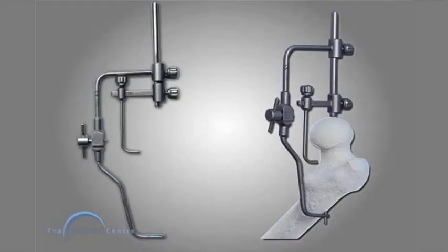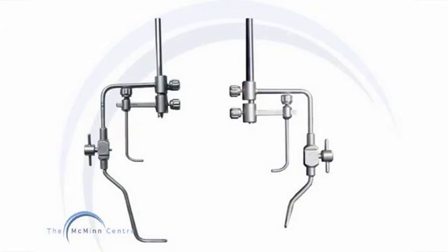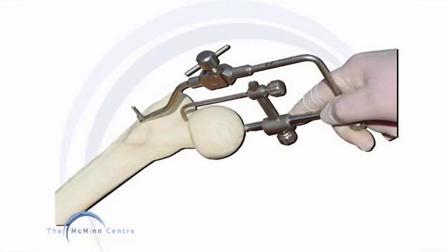This is the old femoral alignment jig, which was in use through the conventional approach. The long arm of the jig had to reach the outer surface of the upper femur. In order to reach that point, a larger incision is needed. Modifications in the femoral alignment jig allow the new jig to be used through a smaller incision, as the long arm of the jig can be anchored to the trochanteric crest.